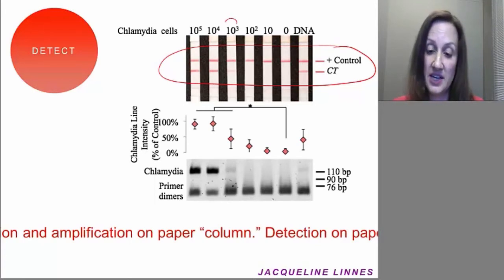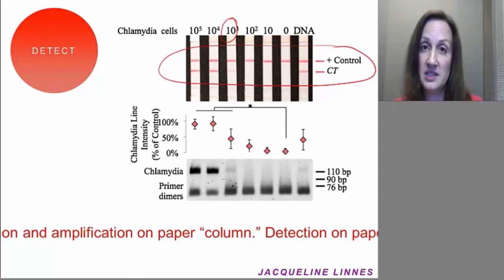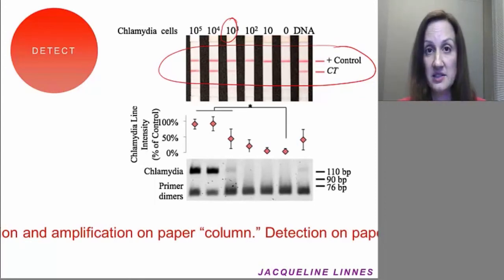However, she's able to detect 10 to the 3 chlamydia cells in a swab sample without plugging into the wall and only using chemical-based methods on paper substrates. Remember, these are not protein-based tests. These are molecular tests. So I would argue that combined, these technologies and technologies like them can lead us to very simple readouts by eye. You're looking directly at the test strip that runs out on the bench to diagnose diseases in a molecular way.